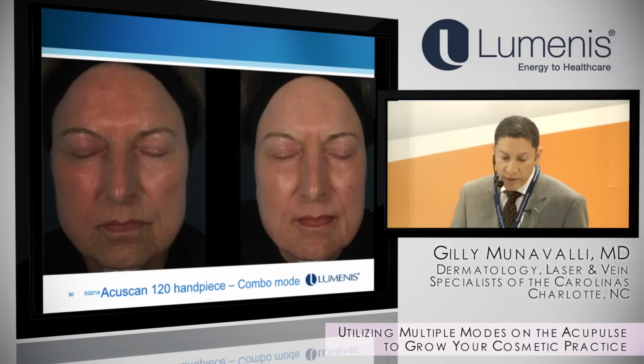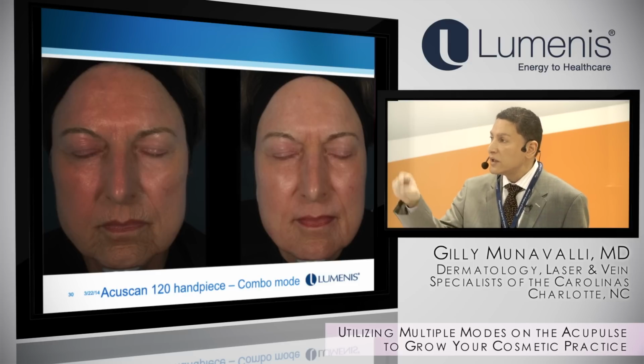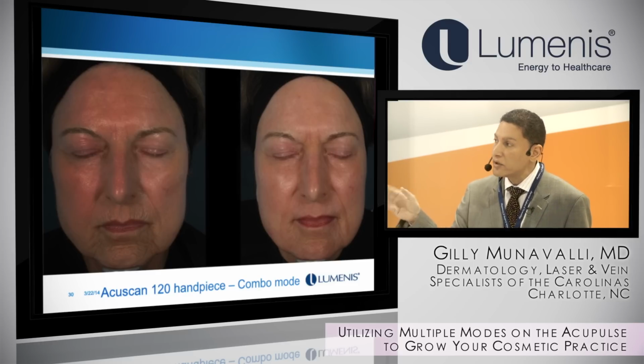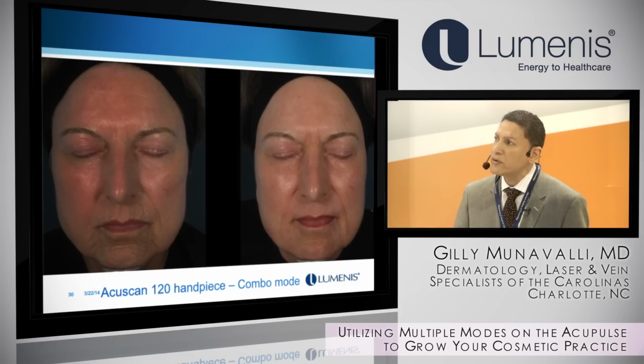This is another one that we did. This is probably the worst case scenario, and this is one we've published in the white paper. But we had to go back. We used the combo mode, but we had to go back and do several passes with the deep. We had to change from the line setting to the pattern to the larger pattern, hit each furrow, do a little bit of wiping. So it's probably about 2 to 3 passes, and then you can see the improvement around the mouth. And she was very pleased with that. But again, I used the combo mode all over to blend everything in.